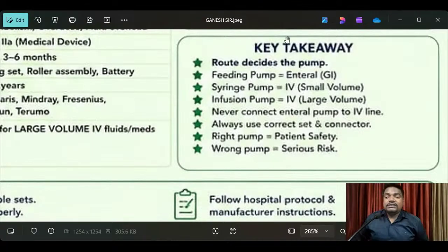So many engineers think syringe pump and infusion pump may not affect the patient, but with wrong medication, so many patients are going to die. Also paralysis, so many things happen. I have observed this many times, and many times I have got such patients. It was one of my experiences, but there we were not the first priority.